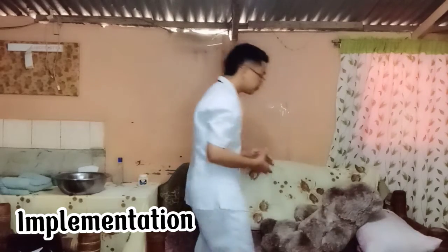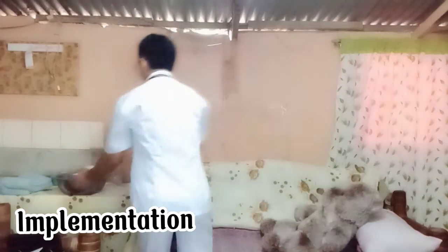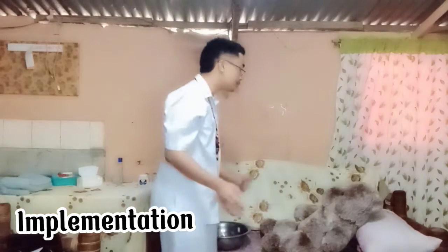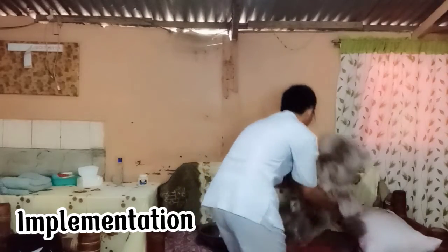Okay. So after that, we're going to assist the client to defecate. So assist the client in a sitting position on a bedpan. So let's assume that it is the bedpan. So we're going to assist you, ma'am, on the bedpan.